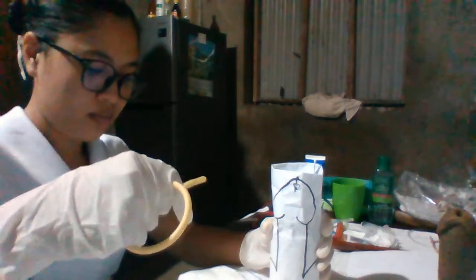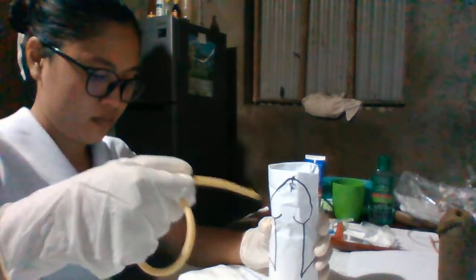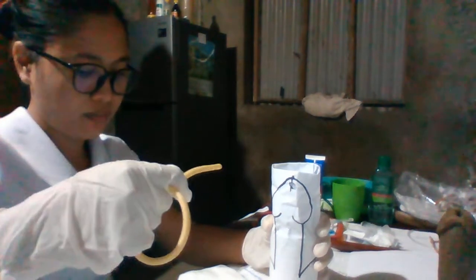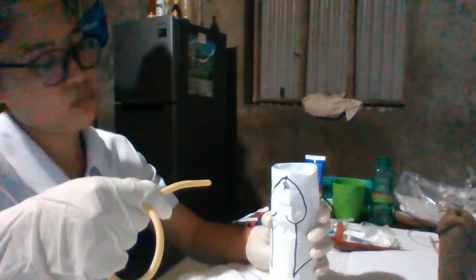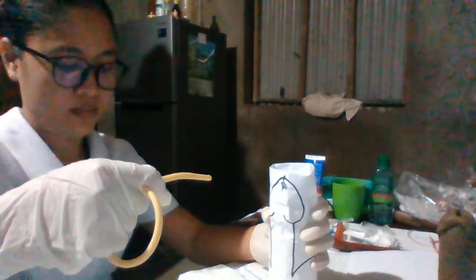Then next, for insertion of the catheter, we need to lift the penis.